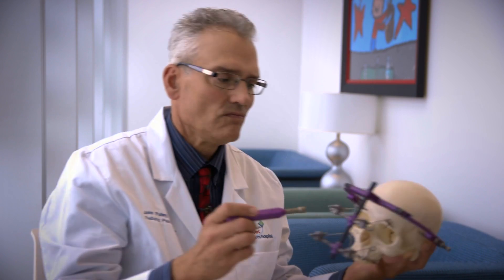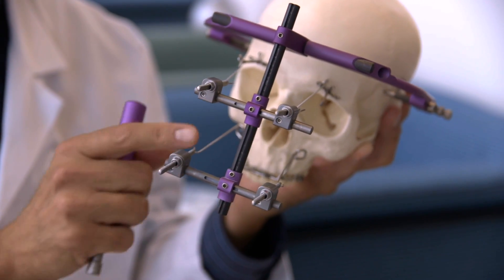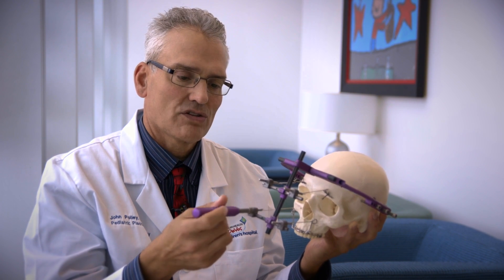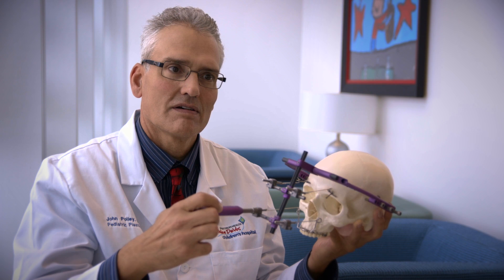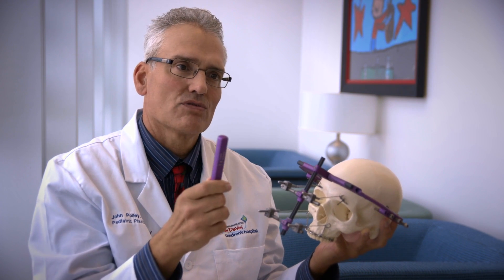So how does that all work? Very simply — we put the screwdriver at the end and make a turn, and we've just moved that portion of the face forward about half a millimeter. Who turns the device? The parents do it, which makes it a very interactive experience in their child's care. We show them how, set everything up, and give them a screwdriver — literally a very simple hex head. It's pretty much foolproof: it tells you which way to turn, makes a little clicky noise, and has little markings so you can see how much to turn.